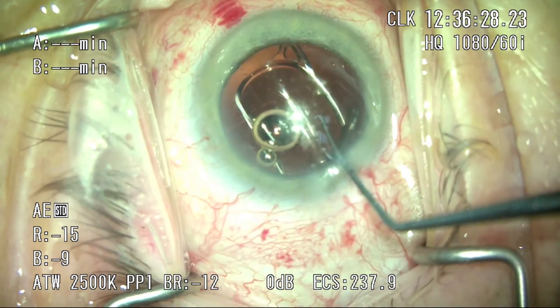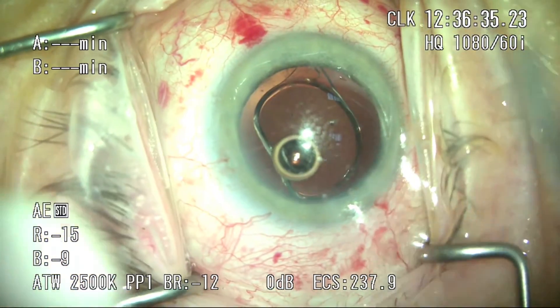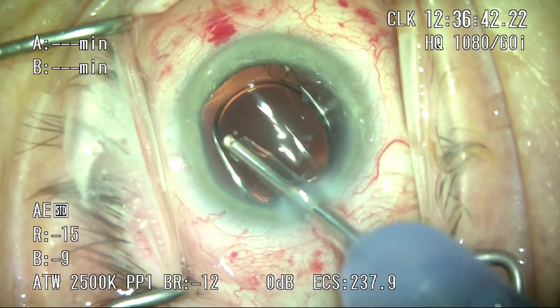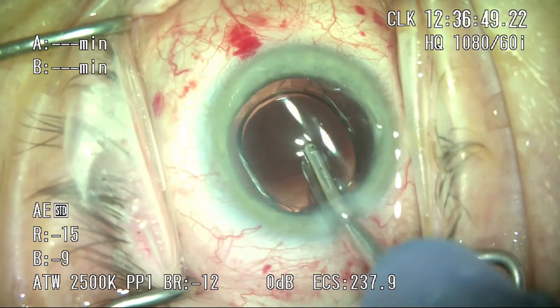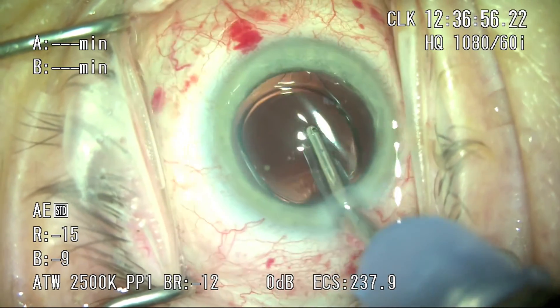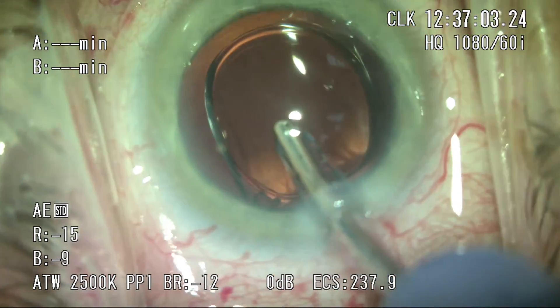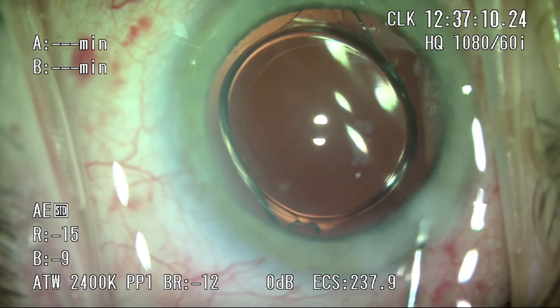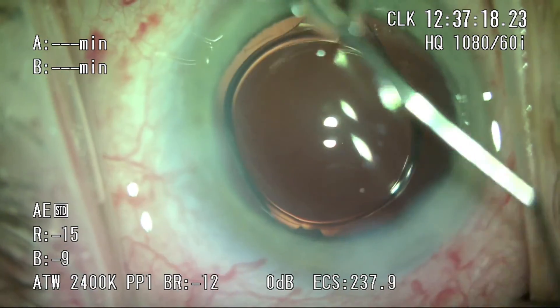While we watch this lens unfold, a quick comment on anesthesia. One thing I've really appreciated is that breaking up the procedure into two separate cases — the femto step and the OR step — patients have responded very well. During their femto step they're not subjected to a full prep or drape. With a bit of sublingual Ativan they're tremendously relaxed, and having experienced no blackout of vision and little to no pain, and knowing half their case is done, they're very relaxed when they come into the operating theater. In the 30 patients we've done so far, we've only had to use IV sedation once — on the very first patient — and since then patients have done remarkably well with sublingual Ativan.